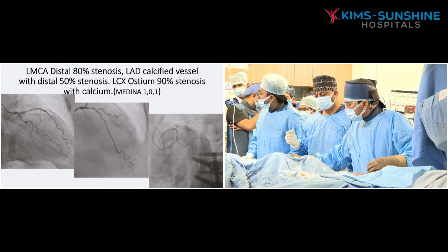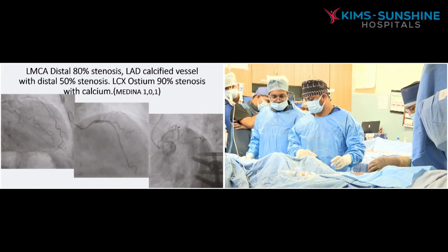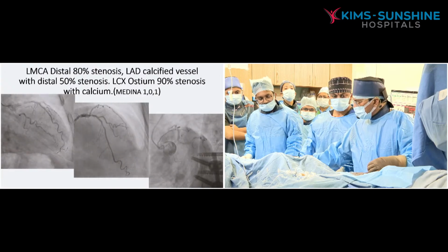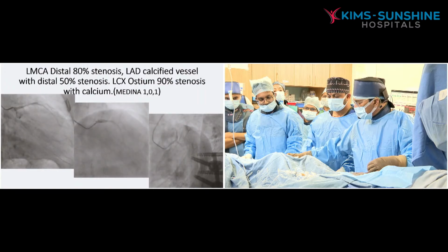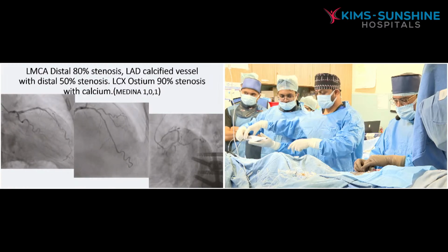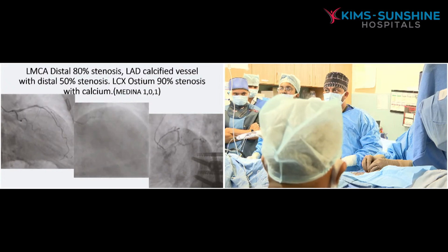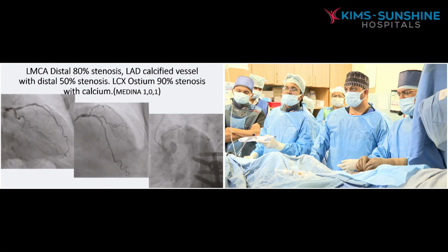Unlock, sir. That way. That way, sir. That way? Yes. It is only 180 degrees. Sir, tap it once. One second. I'll see once again. Last check. Tap it. Perfect. That's it, sir. After 10 seconds, sir, you just come back and then tap it, sir. It will stop. Nearer, let it go then. Nothing will happen. Now we'll start. Now we'll adjust. Keep it in the center.